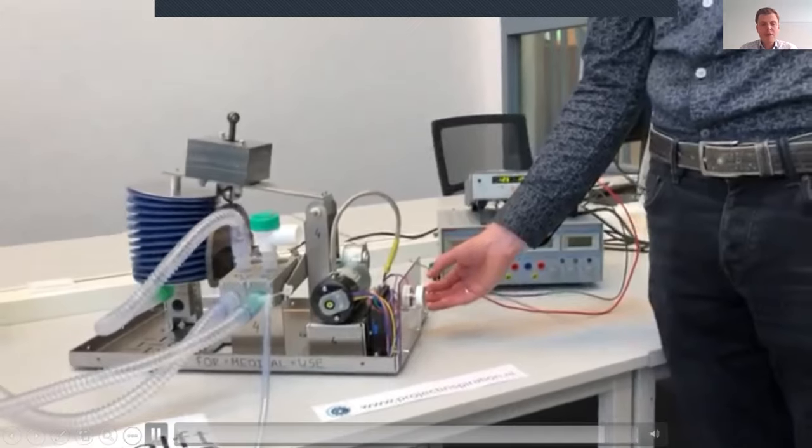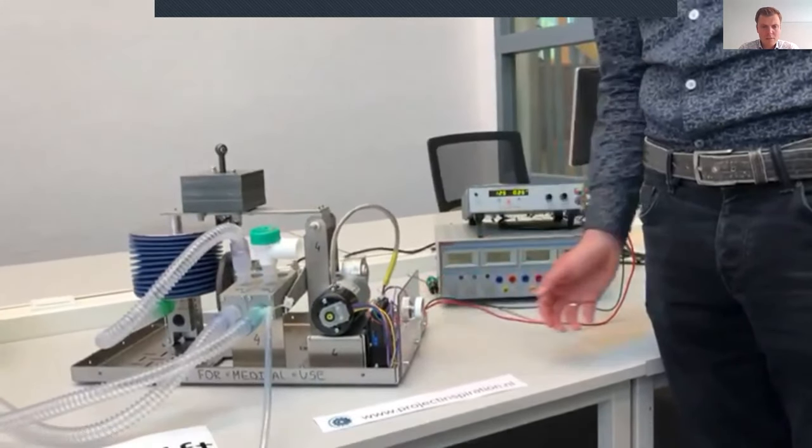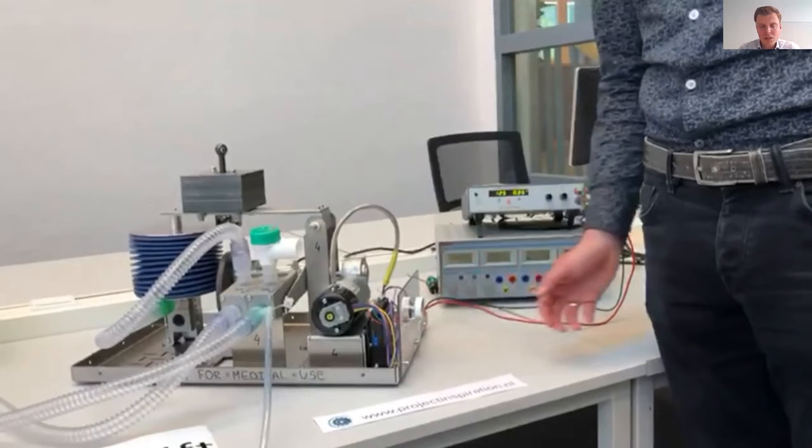As you see, we replaced the gear hub with a speed controller, just a motor controller. But that's actually the only electronics to keep the system running. So there are no really critical components, so the machine keeps running. Once we made the device, we made multiple versions, multiple samples, and one sample we turned on and it has been running now for like 6 or 7 weeks, something like that.